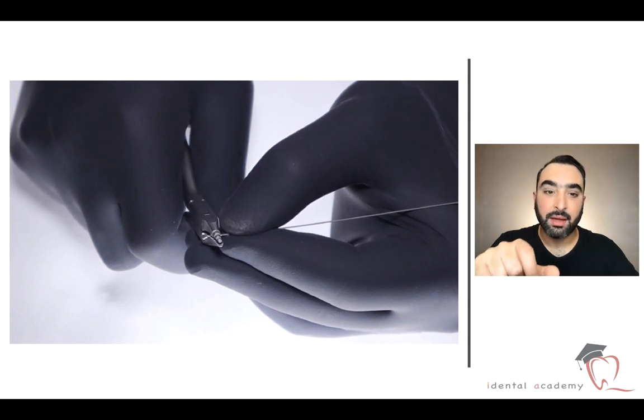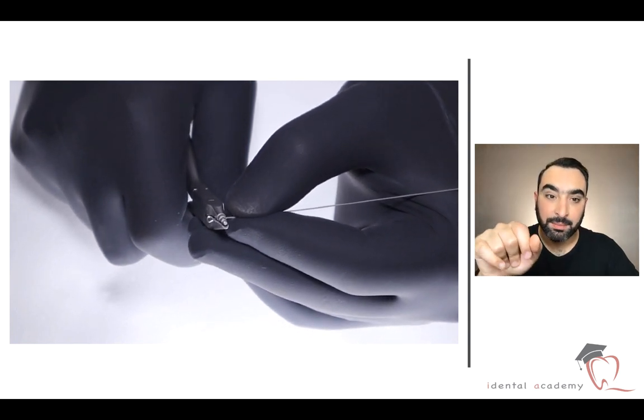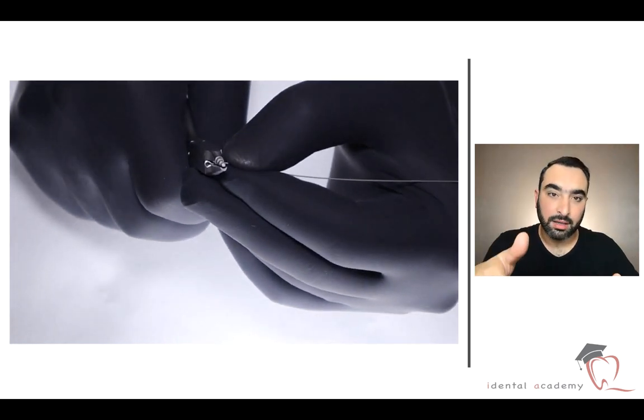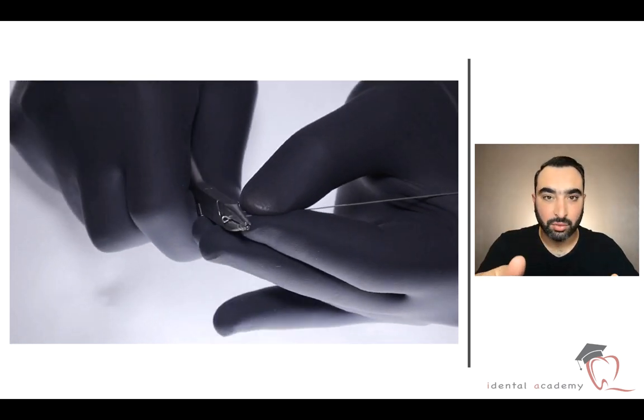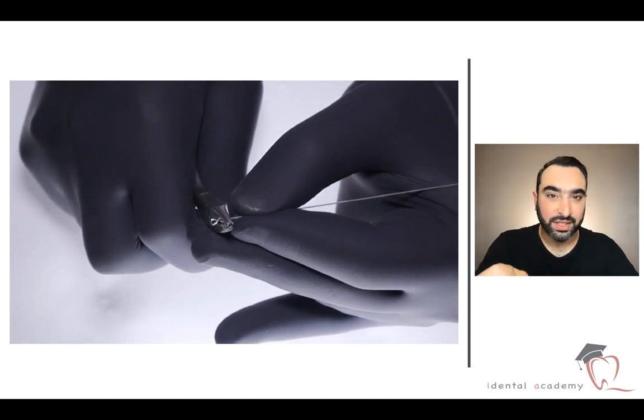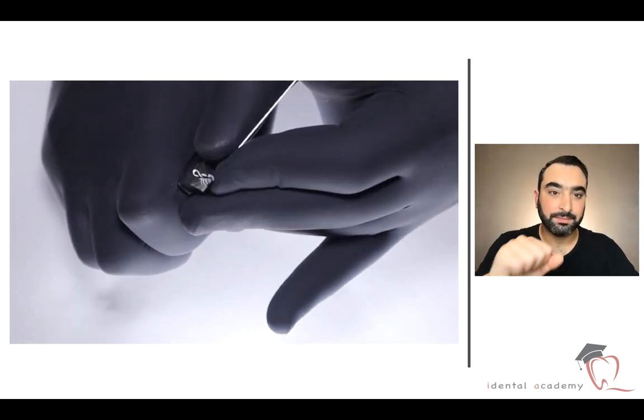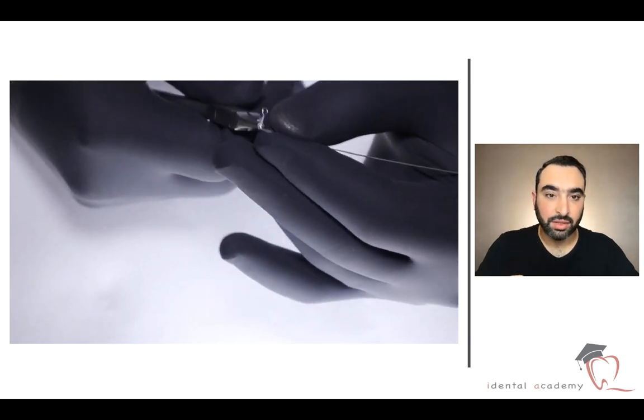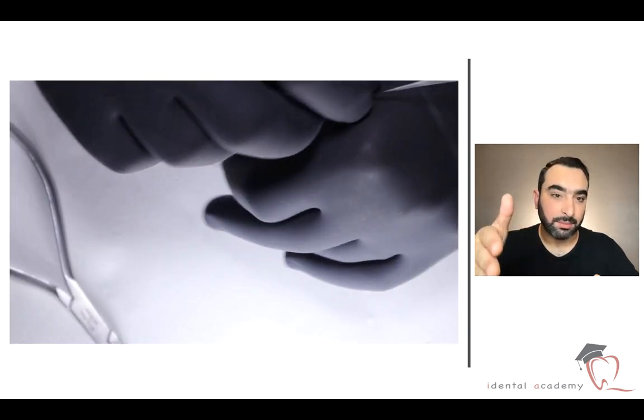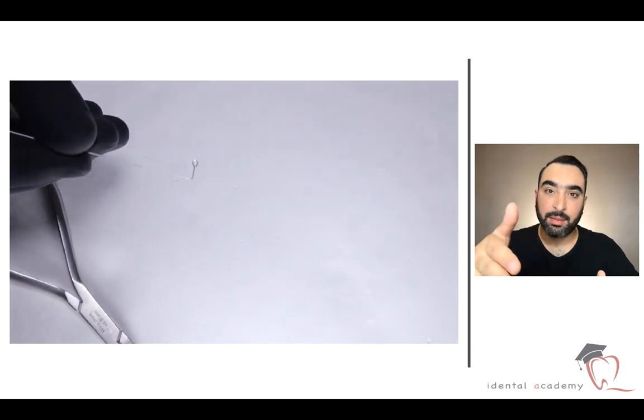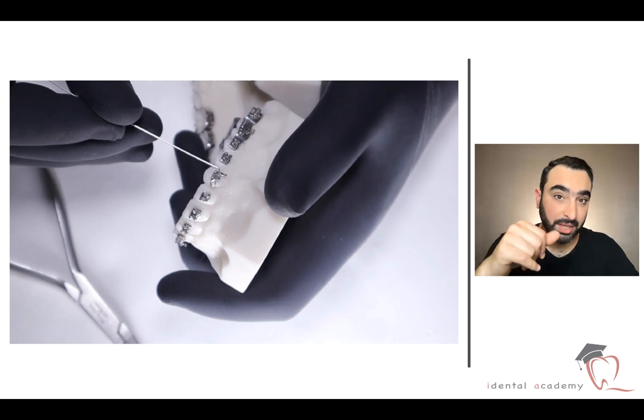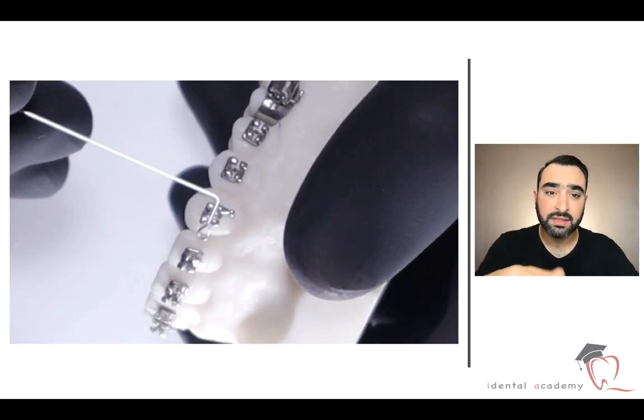After that we have to measure the width of the part that will be inside the bracket. For sure it must be similar to the bracket or maybe a little bit wider to put it inside easily. After that we have to be sure that everything is okay. So we will put the wire on the mouth or maybe you can use the cast if you don't like to make your wire while the patient is inside the clinic.